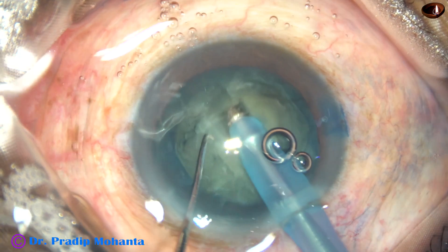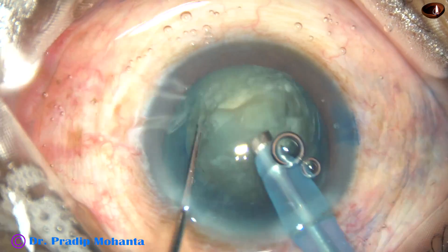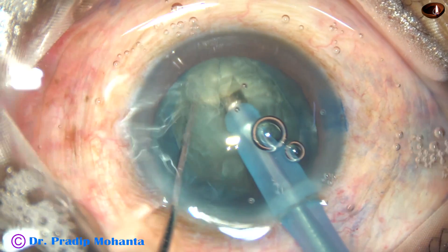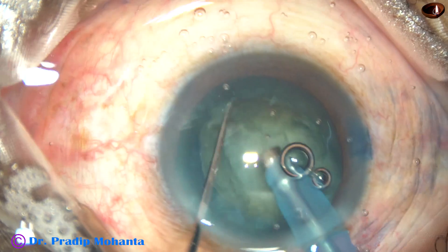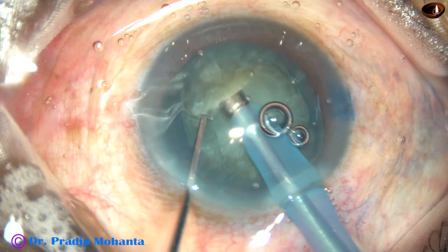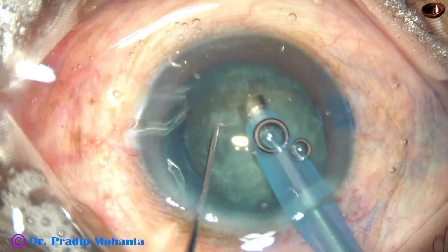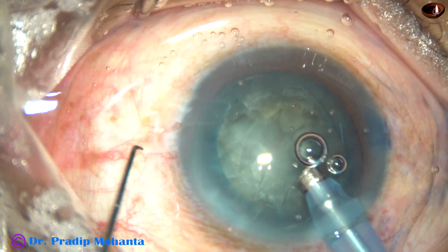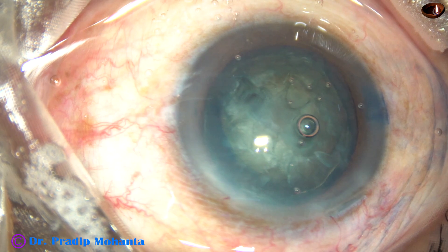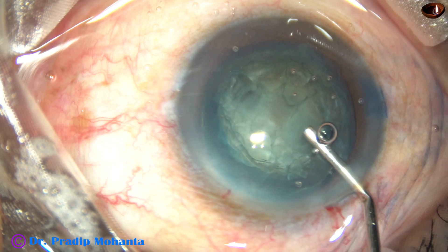As I said, you have to make a deep trench — at least two-thirds of the thickness of the lens. The FACO tip is 2.8 mm, so it should get into the trench at a sufficiently deeper level. Another thing is: if you can see a red glow at the floor of the trench, you are at a sufficiently deeper level.